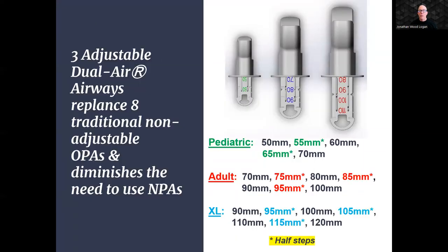To cater to a wide range of clinical scenarios, the NuZone Dual Air OPA is available in three sizes, ensuring that healthcare professionals have the flexibility to select the appropriate size for each patient, optimizing both comfort and efficacy. Our product incorporates five-millimeter half-steps within each size, allowing for further customization. This fine-size adjustment ensures a snug and secure fit, making it suitable for patients with varying anatomical characteristics.